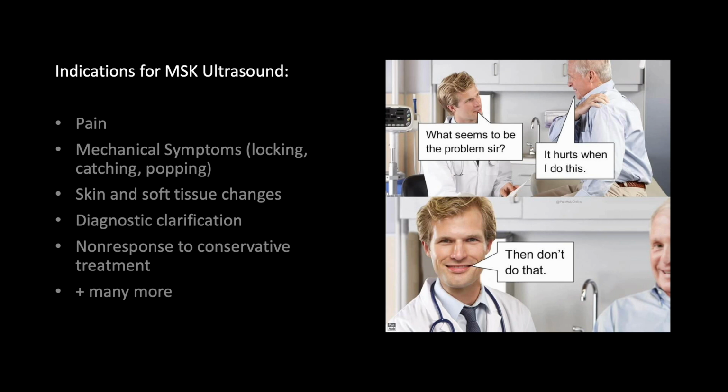Skin and soft tissue changes are another common reason that I'll pull out the ultrasound because of the high availability and resolution of these images using my linear transducer. I mentioned that I use MSK ultrasound techniques for diagnostic clarification, but I also pull it out when patients have tried conservative management for common conditions and haven't responded, sometimes just to confirm that diagnosis or to rule out some things that might otherwise be common. So there's a ton of different reasons why you may want to reach for your ultrasound when evaluating an MSK complaint.